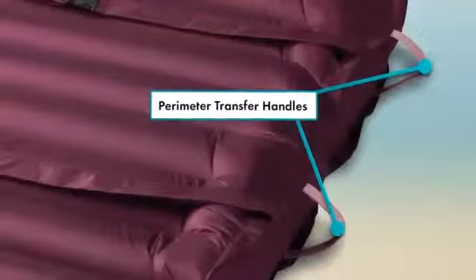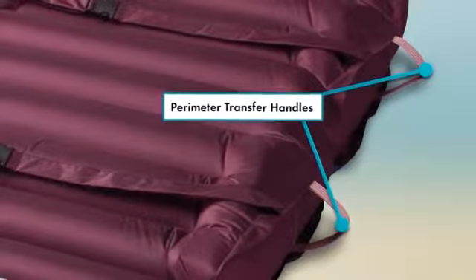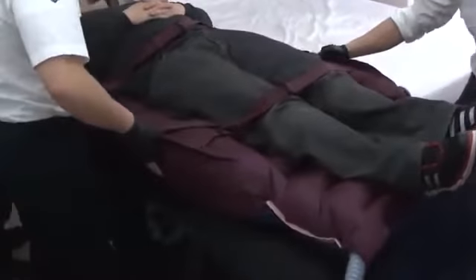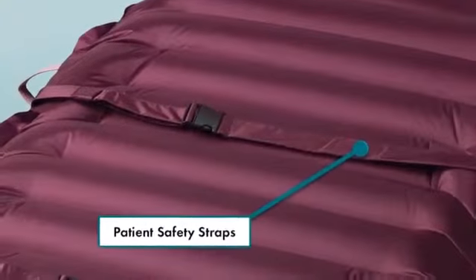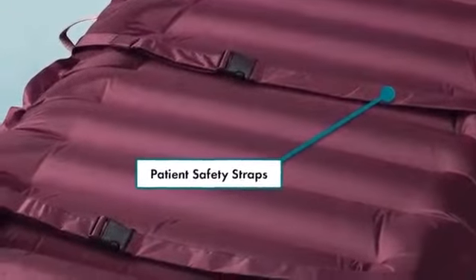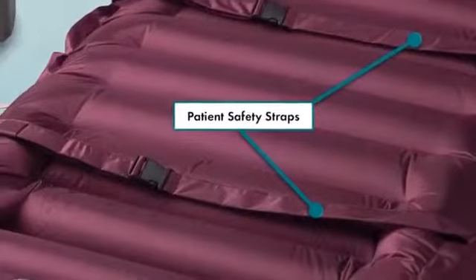The HoverMatt has perimeter transfer handles that are designed to ensure that the caregiver always remains close to the patient for safety during inflated HoverMatt use. This is called the stay close approach. There are 2 safety straps that buckle over the patient. Always ensure that the safety strap buckles are secured for lateral transfers and that the straps are not tight against the patient's body, since they will tighten as the HoverMatt is inflated.